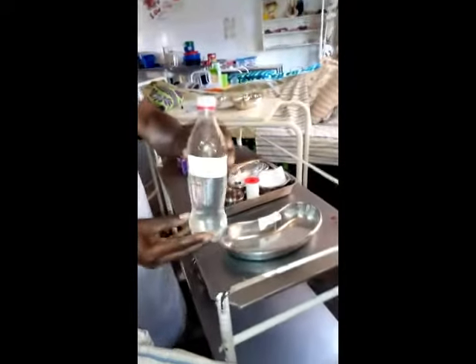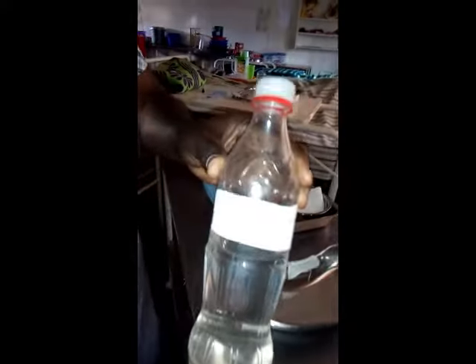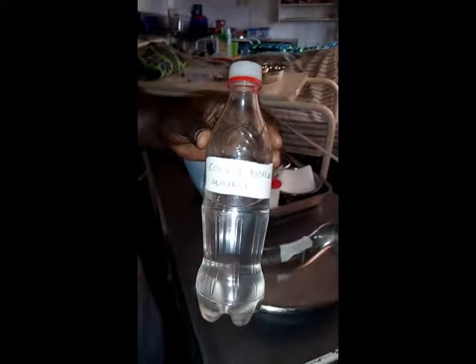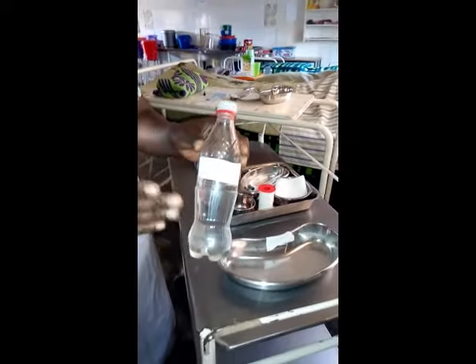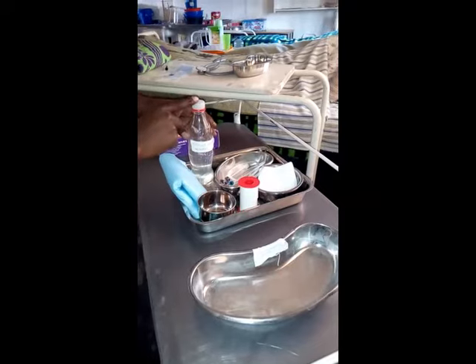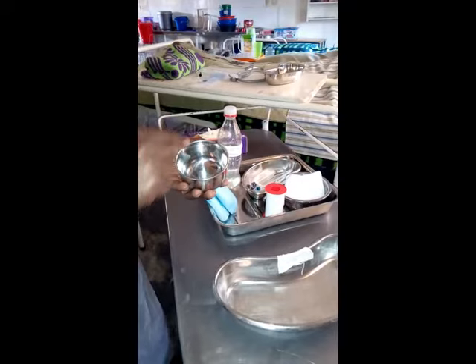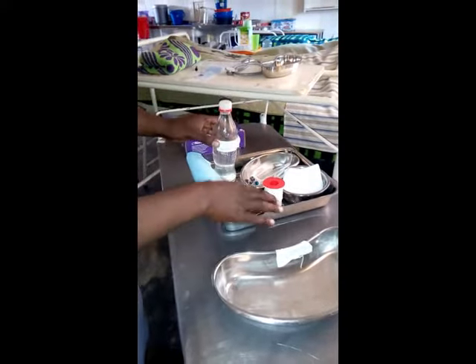Cool boiled water, we're going to use it for lubricating the nasogastric tube. Instead of using KY jelly, in OSCE most of the time we ask for cool boiled water, we don't ask for KY jelly to lubricate the tube. This cool boiled water will move alongside this gallipot. In this gallipot, we're going to pour in cool boiled water for lubrication. So that's how they move.